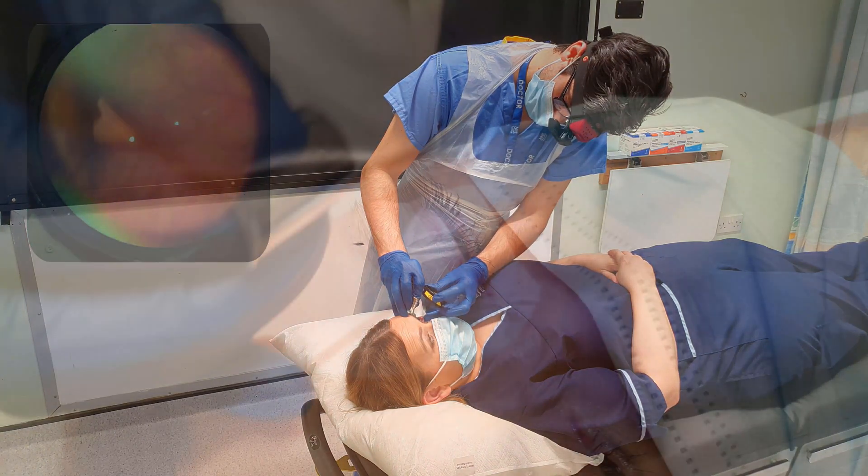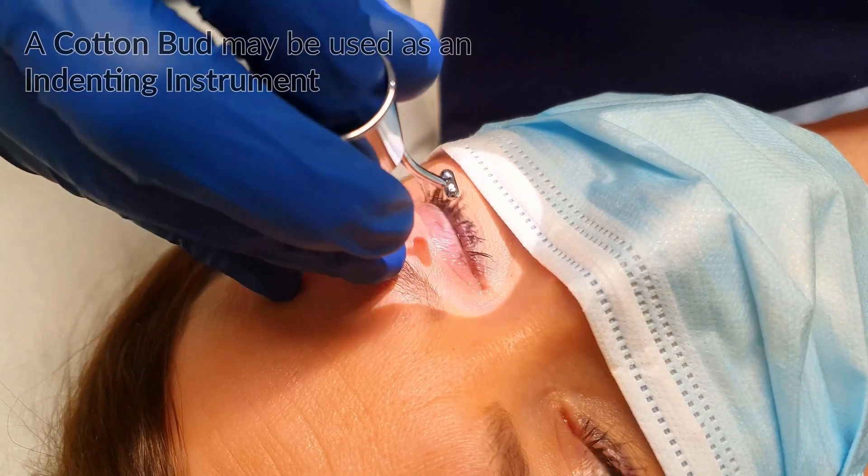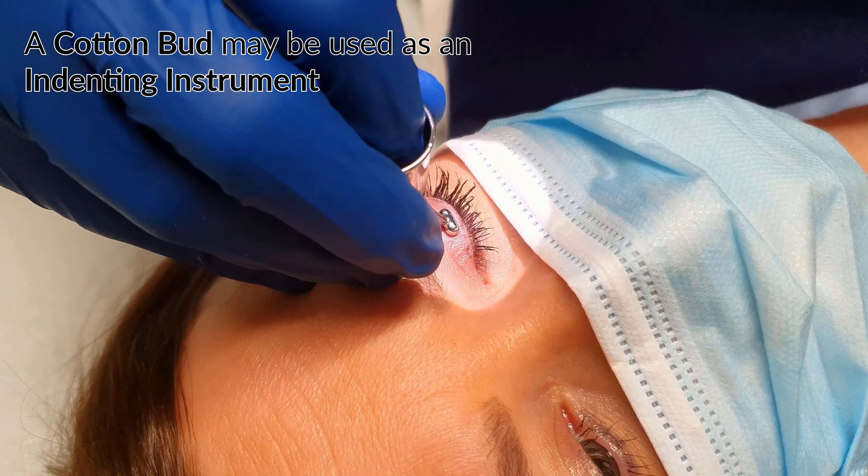You will require appropriate anaesthetic drops and an indenting instrument. You should warn the patient that this may be uncomfortable.